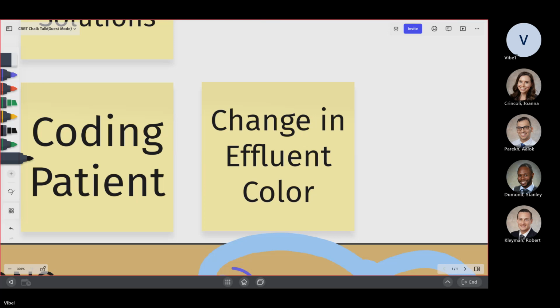Orange pink, that's different. If there is blood in it, if it's pinkish or reddish, then you have to check. Now, sometimes you use methylene blue. If you give methylene blue to the patient, the dialysate, the effluent, is going to come out bluish in color. But anytime there's blood in it, it is pinkish or reddish.